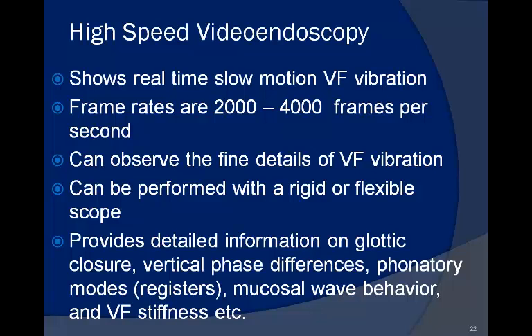So why don't we use high-speed clinically? Early on, high-speed video required a large camera, a very bright light source that generated a lot of heat, and data analysis was time-consuming. In addition, the procedure had to be short due to the heat generated by the bright light source, or the patient could be burned.